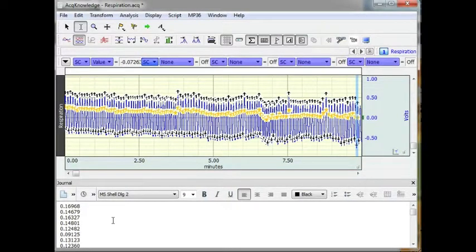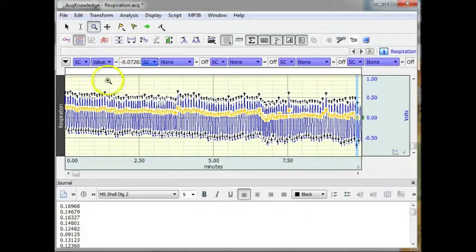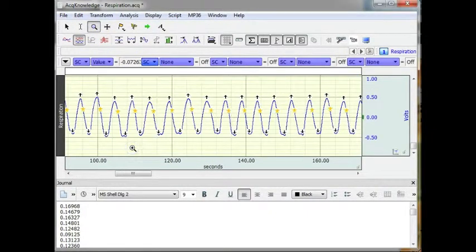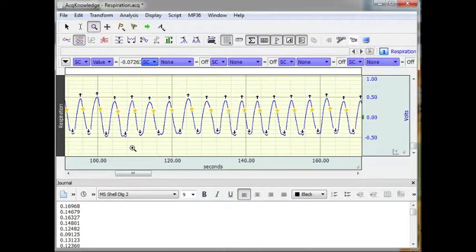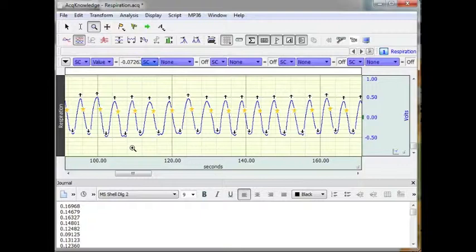So this gives you a quick demonstration of how the software or the fine cycle peak detector can identify specific events within the waveform and place an event marker that can be used for further analysis. And that concludes this part of our demonstration.